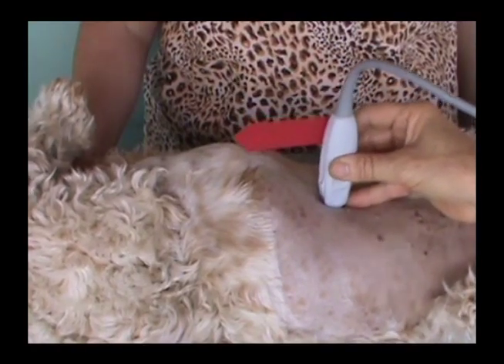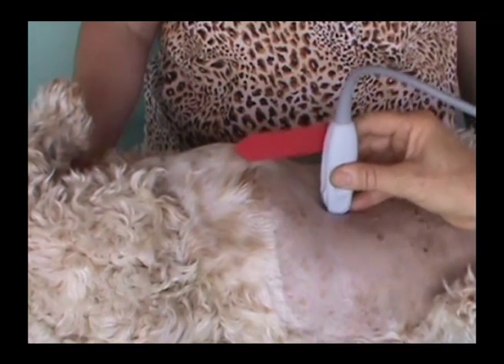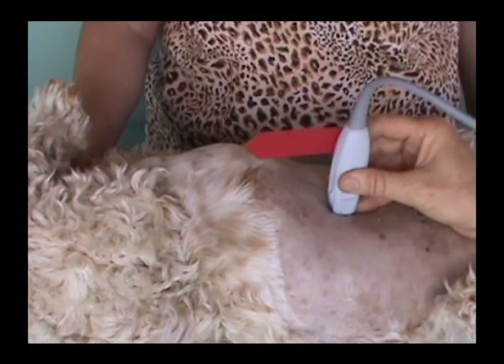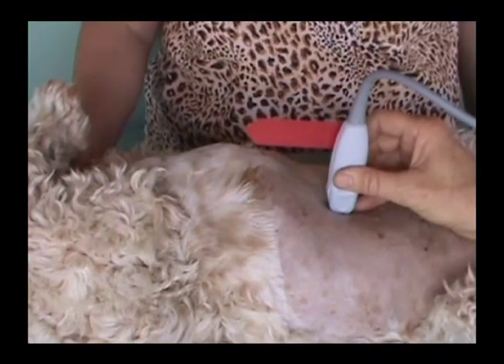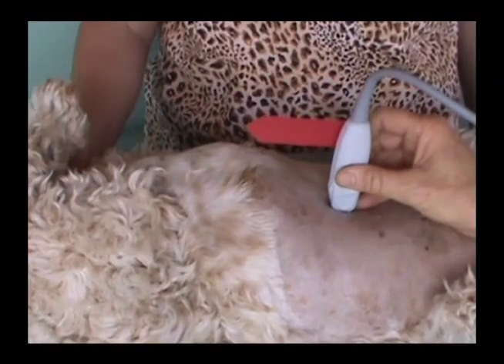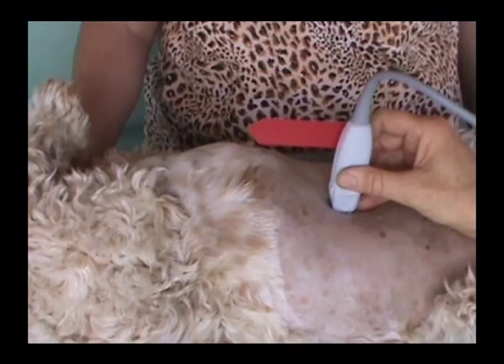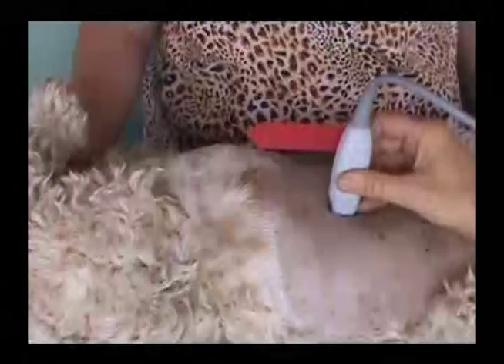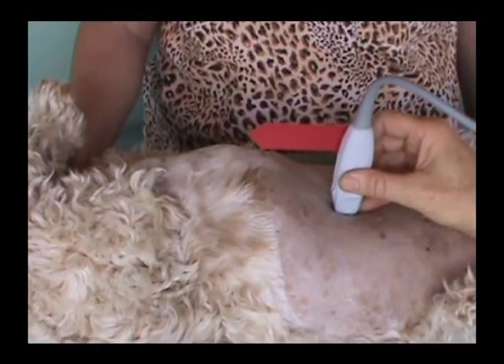You can anchor the edge of your transducer hand to the patient's body. If possible, lay your forearm on the patient's body as well. After dousing the patient with alcohol and then applying cold ultrasound gel, the warmth of the contact of your hand and forearm are soothing to the patient. If possible, you may also rest your forearm or elbow on the ultrasound cushion or exam table.